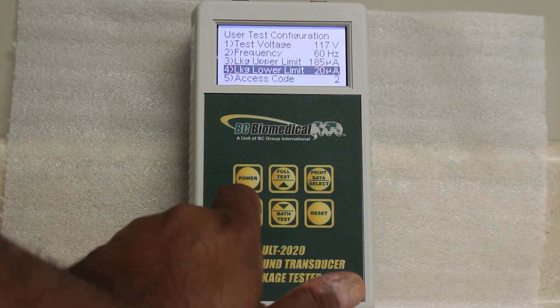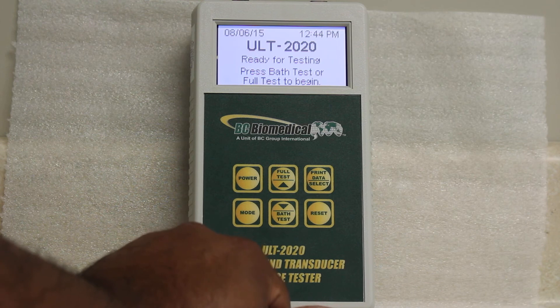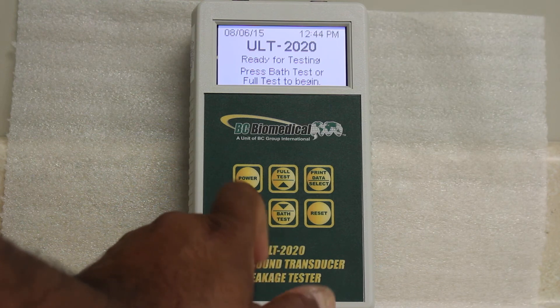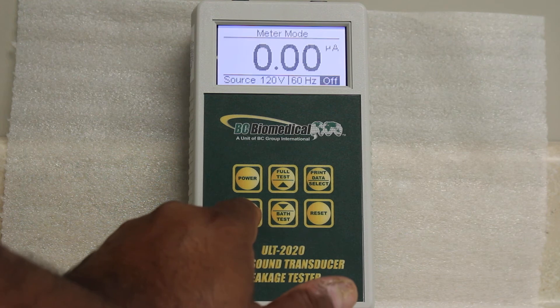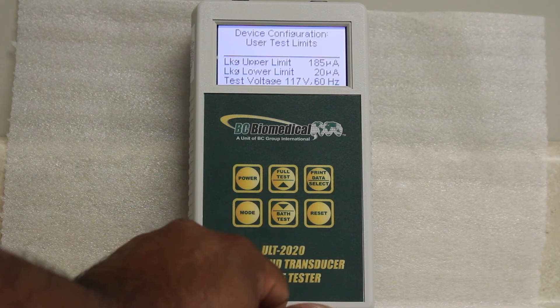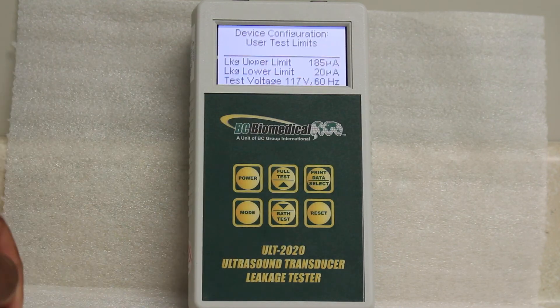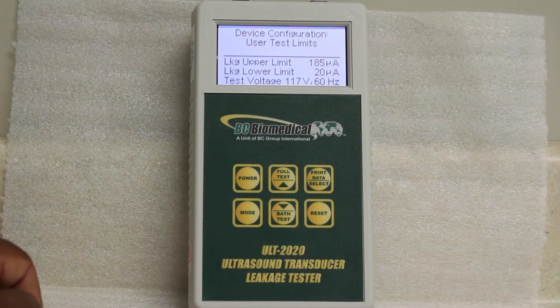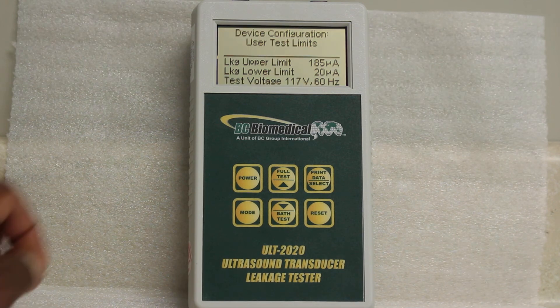Once you're all set, press the mode button to exit out of that. Then you click the mode button once, twice, and a third time and it tells you what you set it to — leakage current is set to 185 on the upper limit and 20 microamperes on the lower limit.